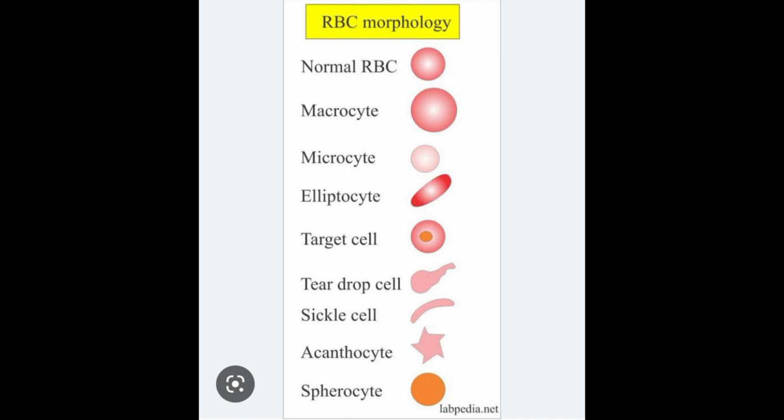Acanthocytes. These RBCs are irregularly shaped with thorn-like projections on their outer edges. Their presence is called acanthocytosis. Such type of RBC can be seen in hepatic and renal disorders. Abnormalities in normal count of RBC. Nucleated RBC. These are immature RBCs with a nucleus. These are also called erythroblasts. They are seen in megaloblastic anemia, severe bleeding, and leukemia.